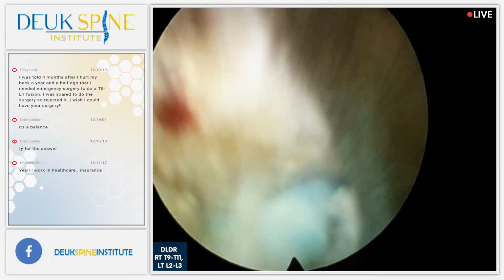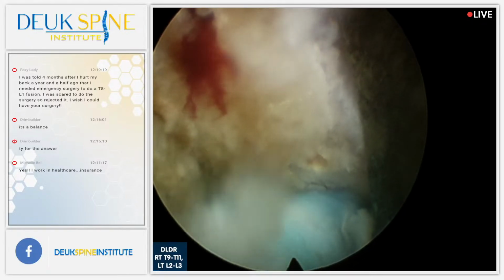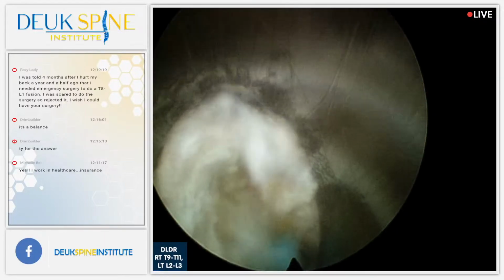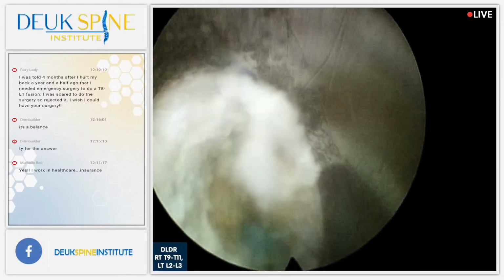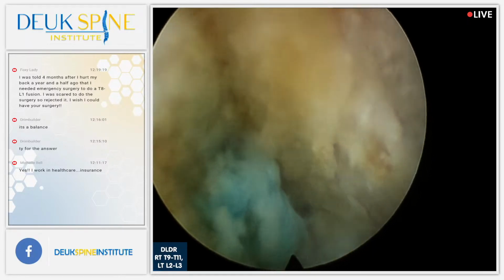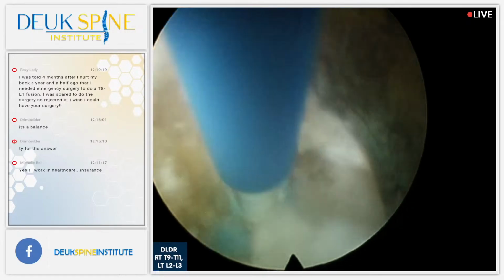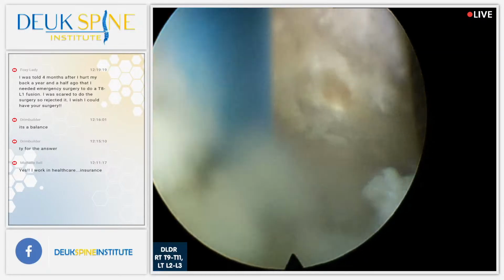Wait. Hold on. Oh, look at that herniation that just popped out. That's crazy. There was nothing there a second ago, and now it's coming out. It's a good thing I looked. Oh yeah, there's a few pieces down here. Nothing major, but thank you, Louis. Still want to jiggle it out if I can. Let's get the laser. Laser's far better than that. Anyway, this blue thing is a herniation. And there it goes. See how the laser releases it from the scar tissue that it's holding it in?